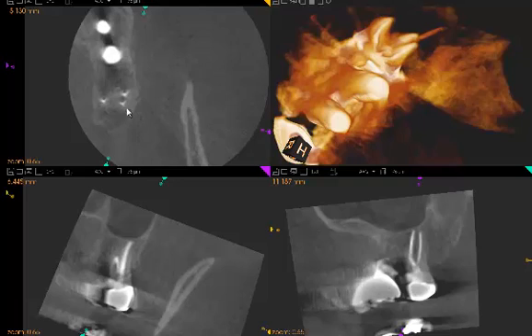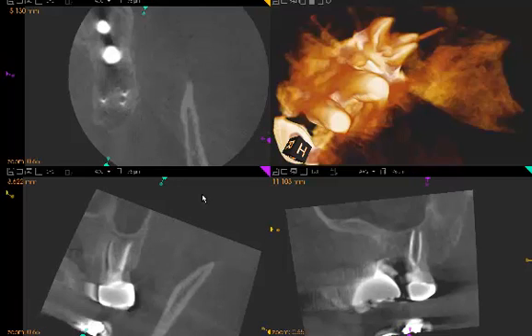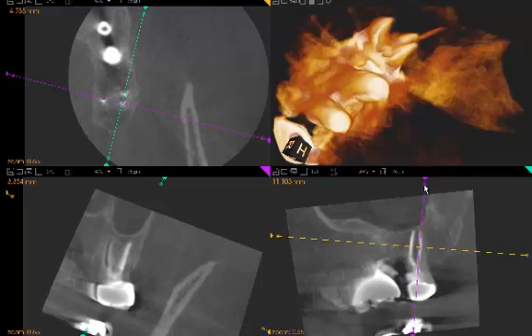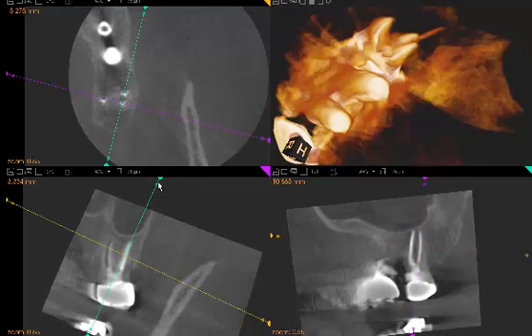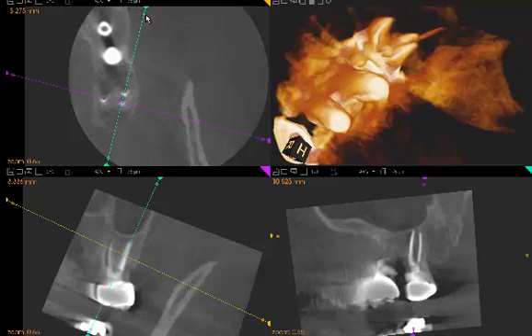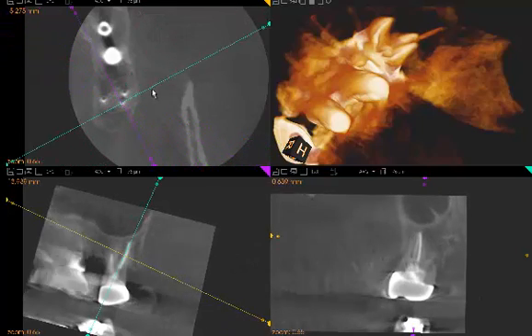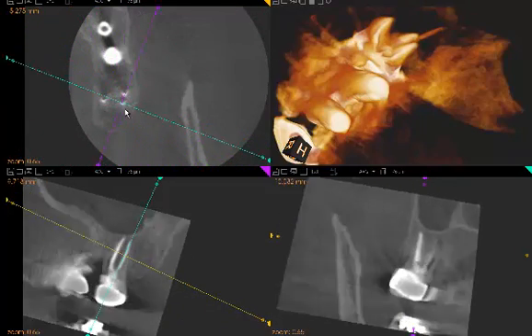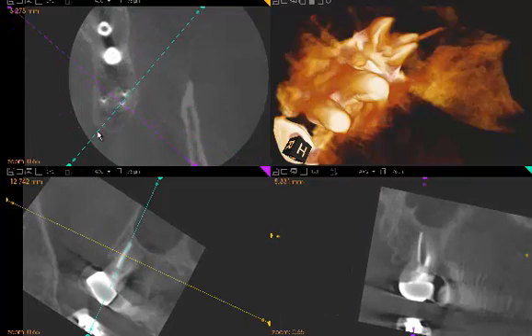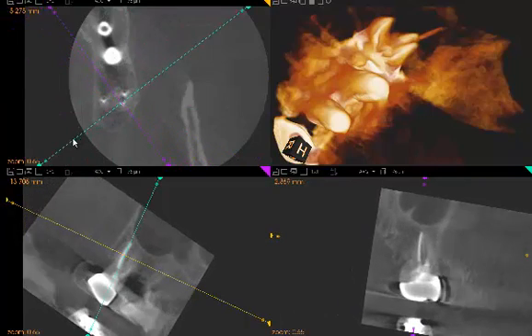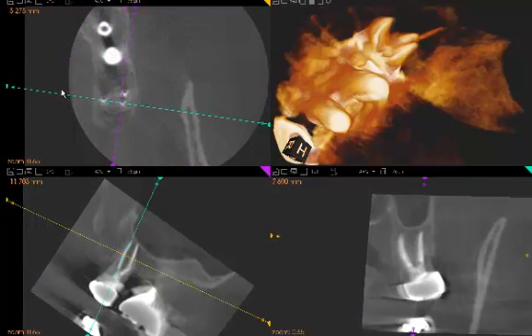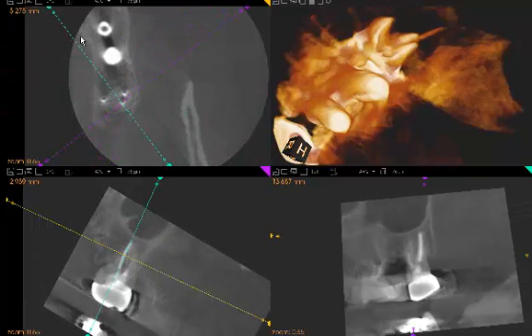Finally, going through and rotating like a top through the distal buccal root, you can see that the bone looks almost perfect in that root. There appears to be no PDL space widening, and the bone looks very clear. For the most part, I would judge this treatment as a success, and my 10 years of being concerned about it — I'm now relaxed.